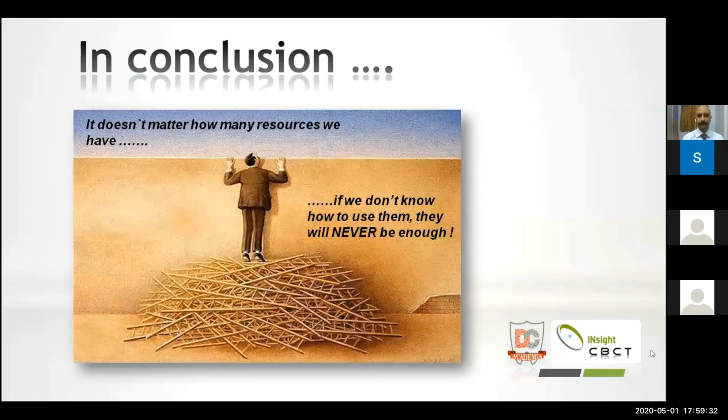So to begin with, anybody who has never done it needs to get a little more comfortable by using the software, taking assistance from some of our colleagues, and planning it yourself, so you know exactly how you intend to place those implants. And then once the guide is fabricated, it becomes very easy. You know exactly how you had planned and how you are going ahead with it.